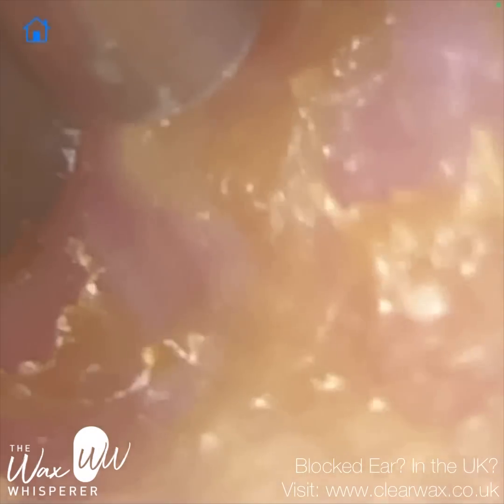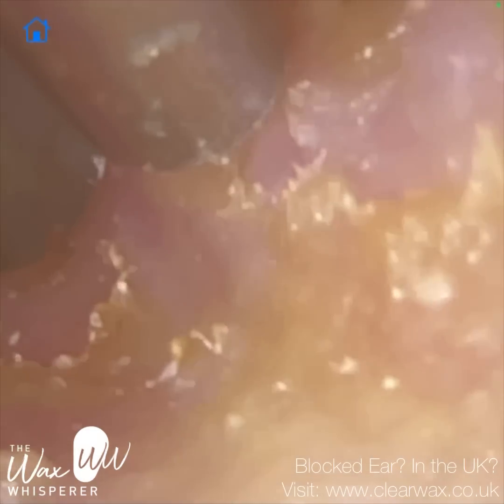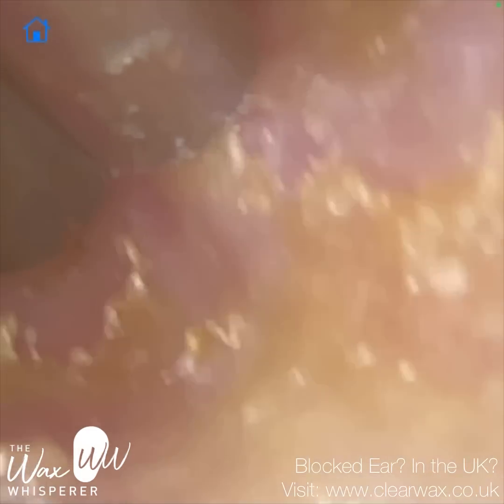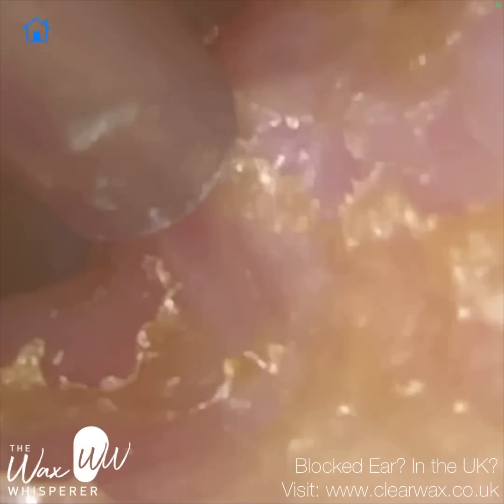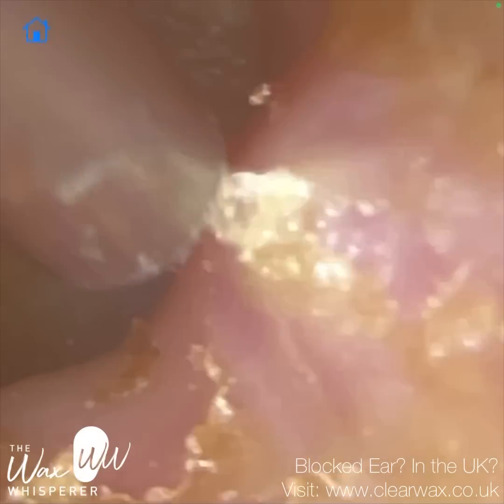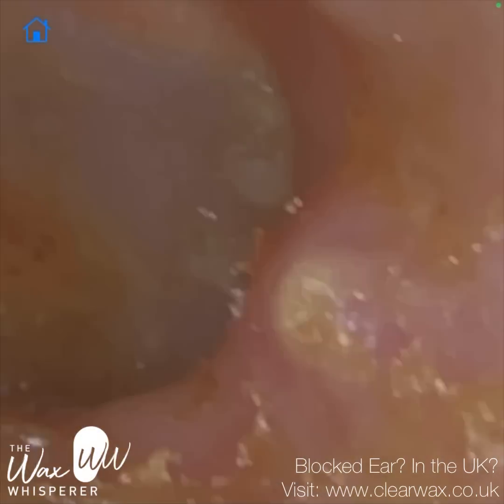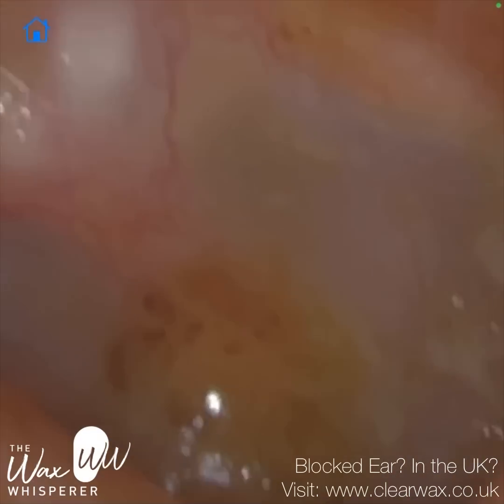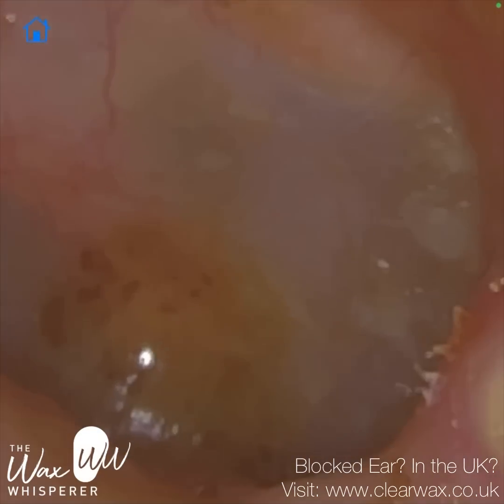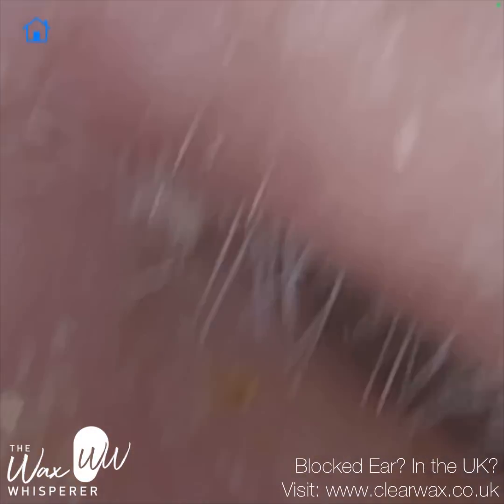You can see the bony part of the ear canal being revealed. We're just going to kiss the surface here. And if you do make contact with the bony part quite aggressively, the patient will flinch — and if the patient flinches while we're inside the ear with two potentially dangerous objects, the endoscope and the sucker, you've got to be careful. That was the reason I was just making sure there's no discharge in that region, and there wasn't. It's a bit of sticky keratin wax — like caramel on the ear.